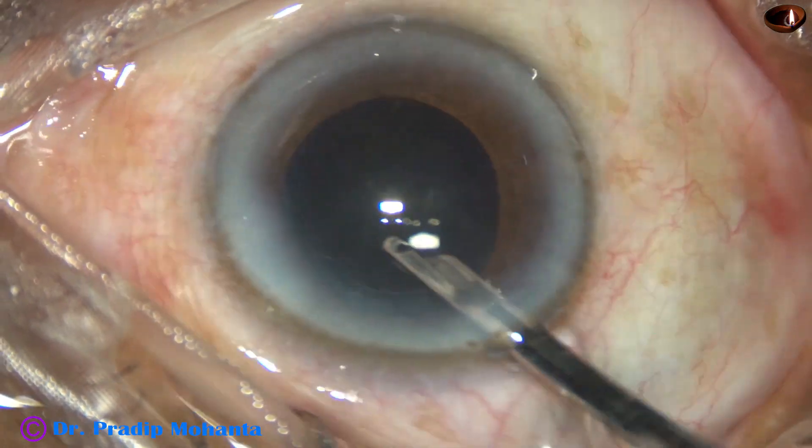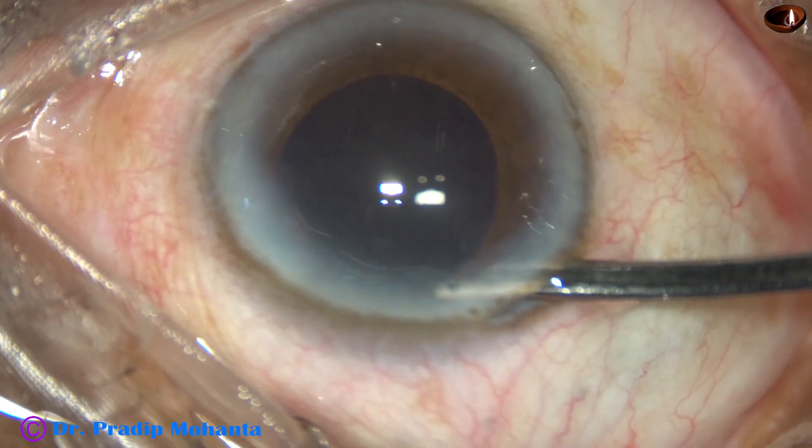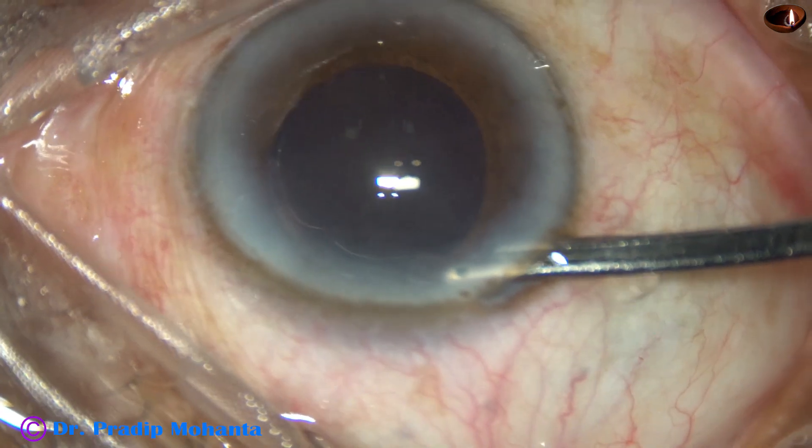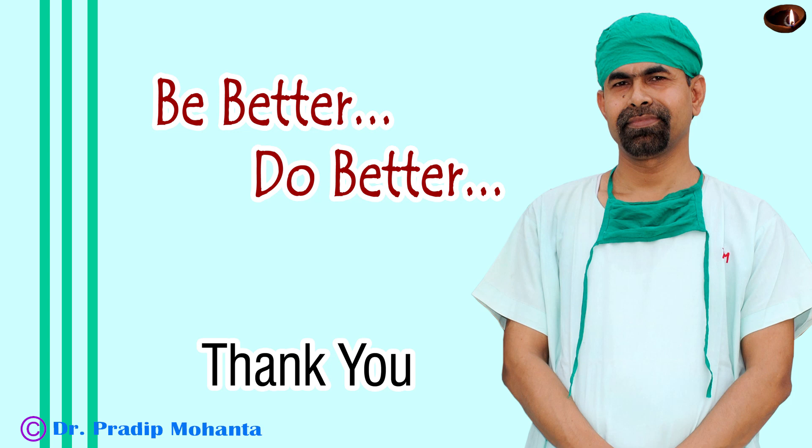This is the final lavage of the anterior chamber. The anterior chamber is formed and the case is concluded. Thank you very much for your attention. I hope this video will help you in developing your surgical skills — be a great surgeon and serve your patients with love, respect, and great surgical competence.